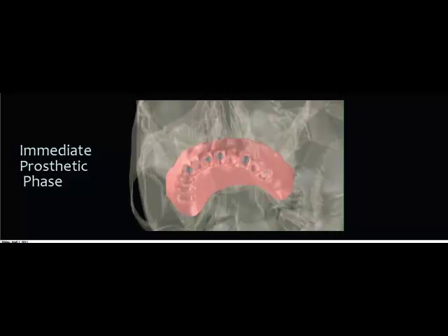Once the occlusion has been calibrated, we're going to take off the prosthesis, and we're going to fill any voids that have been left over and polish any areas where we have any flash of material. The bridge is then screwed back into the patient's mouth, the anesthetic is worn off, and we always have a happy patient at the end of this type of procedure. They cannot believe how beautiful their smiles are, how we were able to address all these aesthetic concerns without any try-ins physically in their mouth.